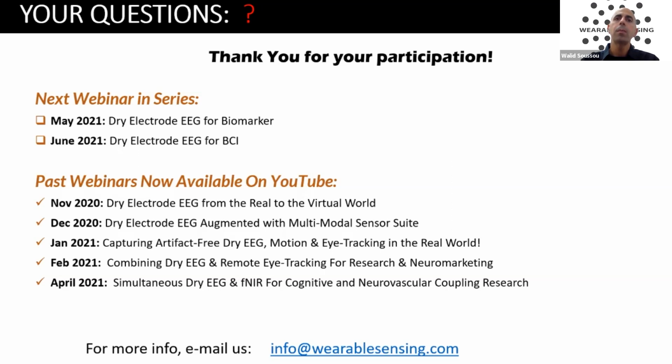You can also use that trigger hub to synchronize with other devices such as the eye trackers or motion trackers, etc. Let's get another question come in.